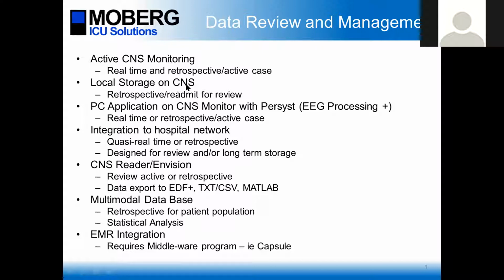Local storage on the CNS, that's what we just talked about within that managed data file. This lets us look at data after the patient's been discharged. So we're looking at it retrospectively, but we do have the ability to readmit that patient for further review if we want to. So that's another way to review and manage data.